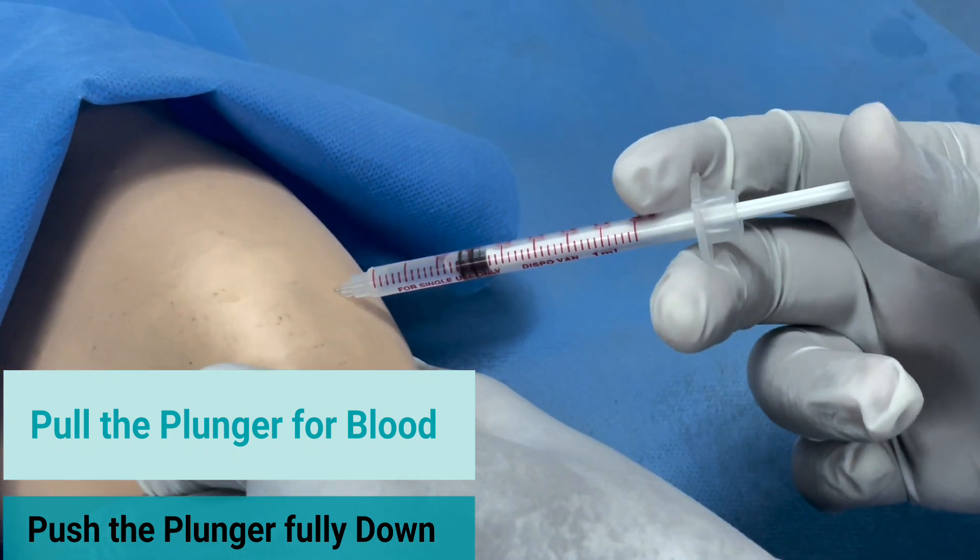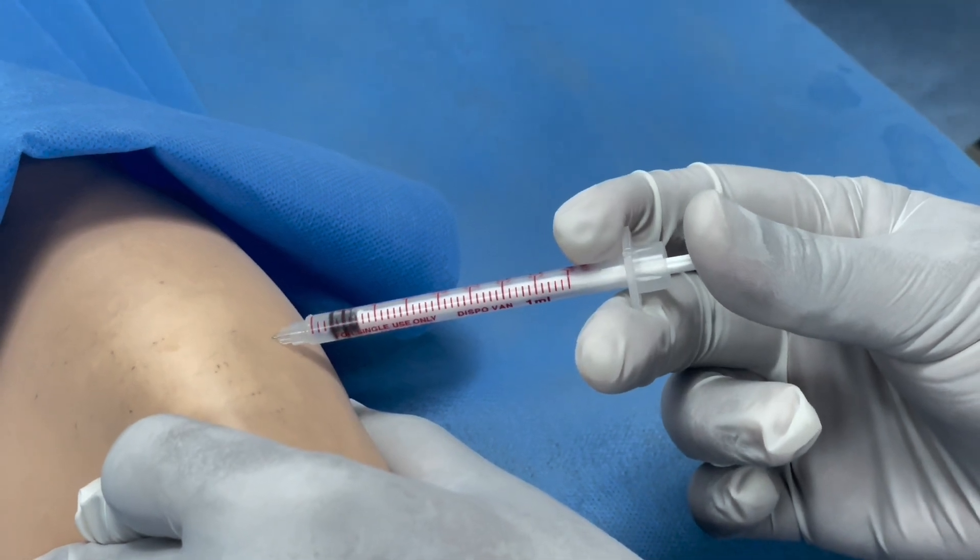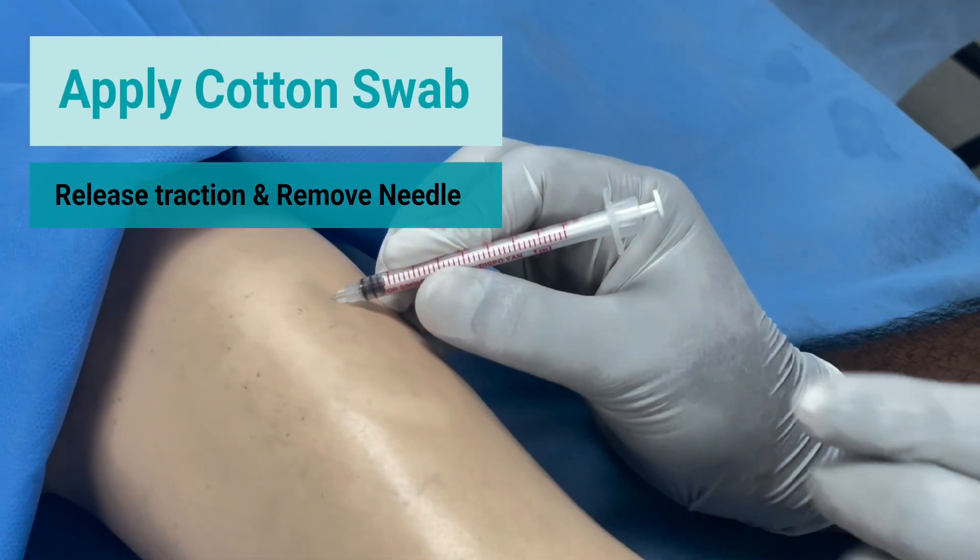Pull the plunger to look for any blood that is aspirated. If none is present, push the plunger fully inside to deliver the drug.